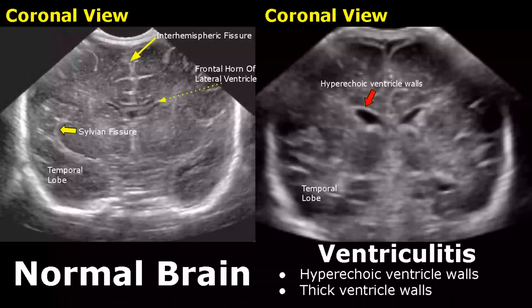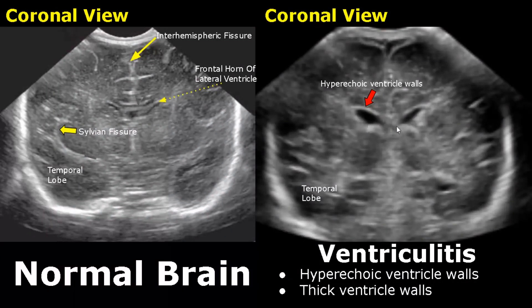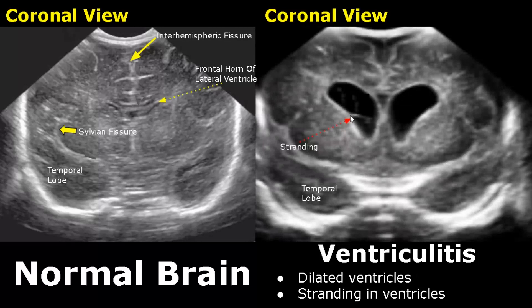Ventriculitis is the inflammation of ventricles. The wall of the ventricle will be thickened and appear hyperechoic. Another feature is stranding of wall tissue in the ventricles, and the ventricles are much more dilated in this image.